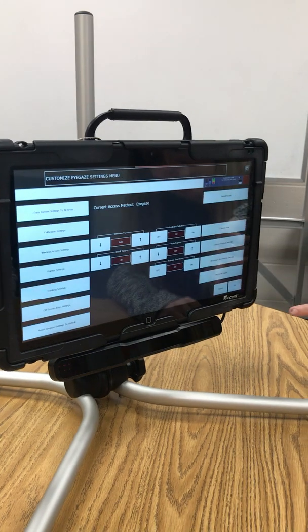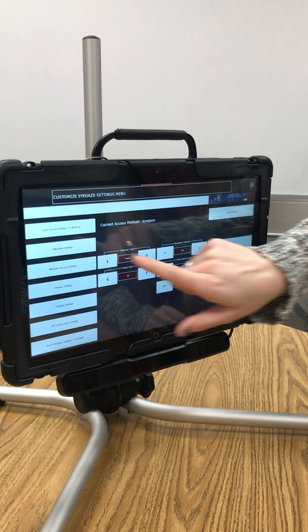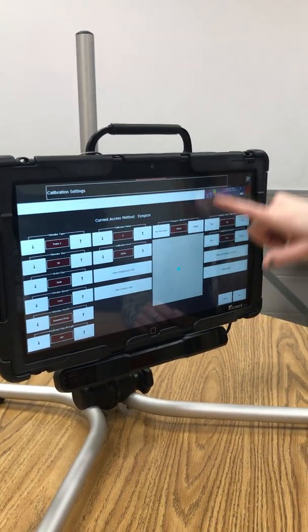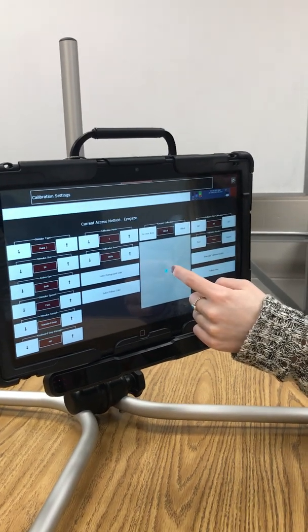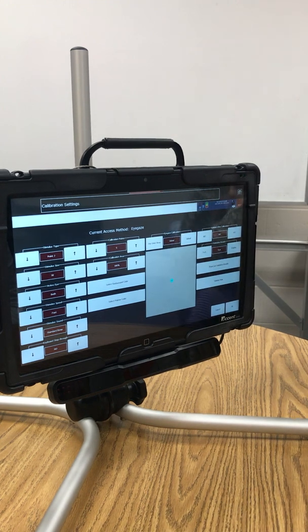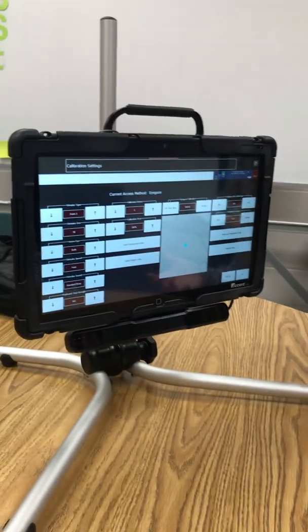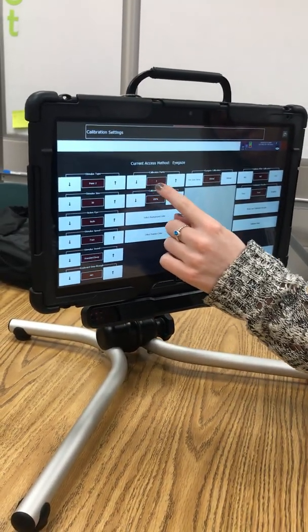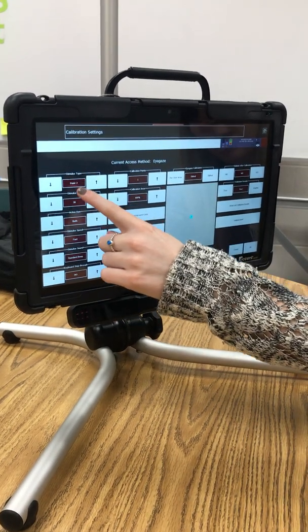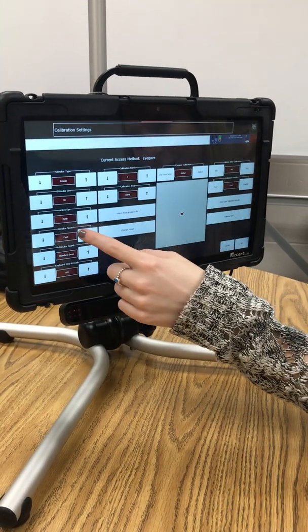So then I go to calibration settings and I bring it down to, this is how, if you want it super in tune with your eyes. So if she was typing little tiny words, this would be a bigger deal, but for her it's not a huge deal right now. So I bring it down to 1 calibration point. And the stimulus type, I put it as a butterfly because that's more fun.